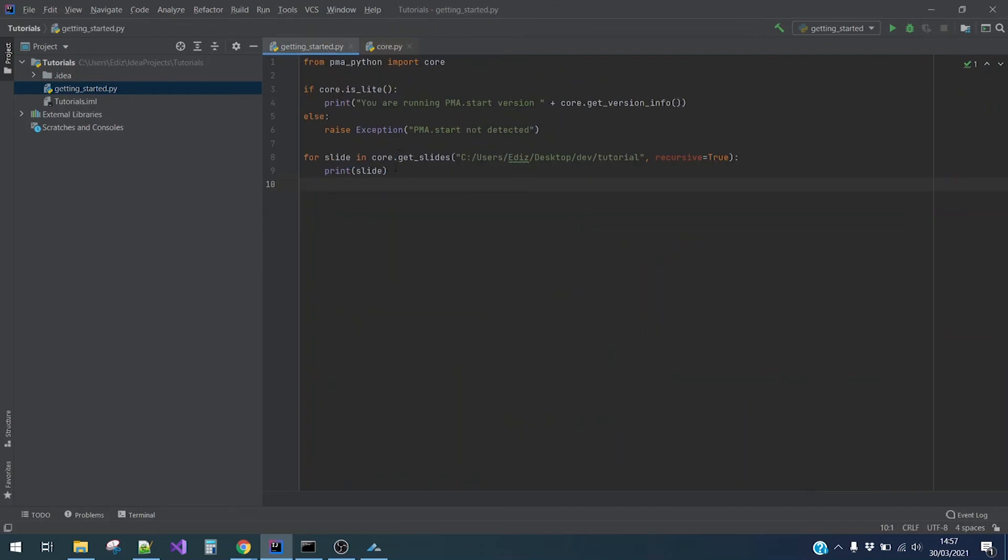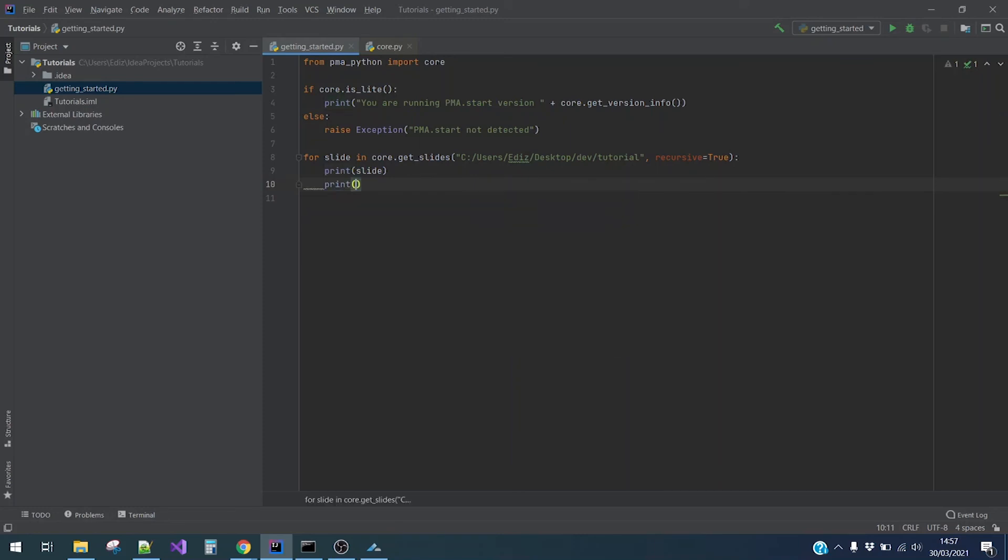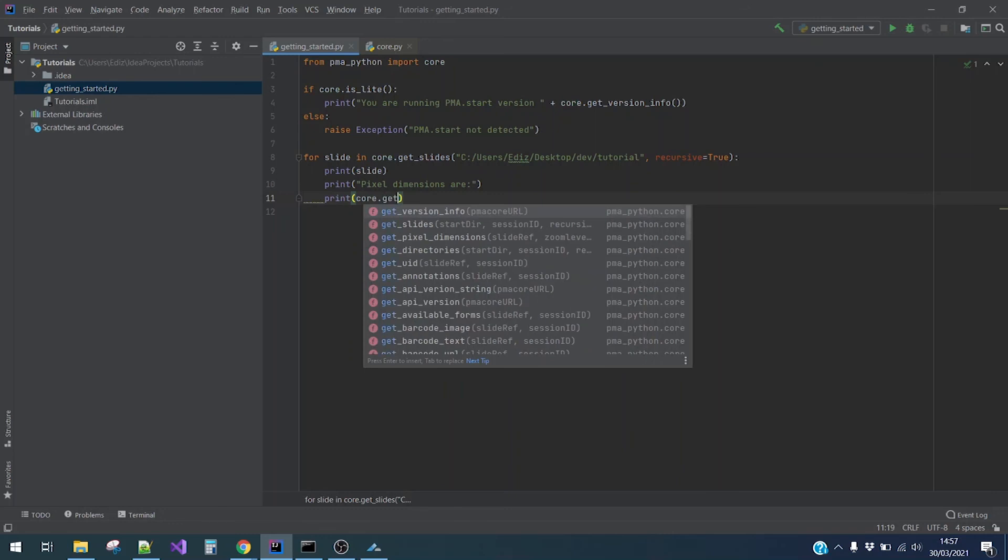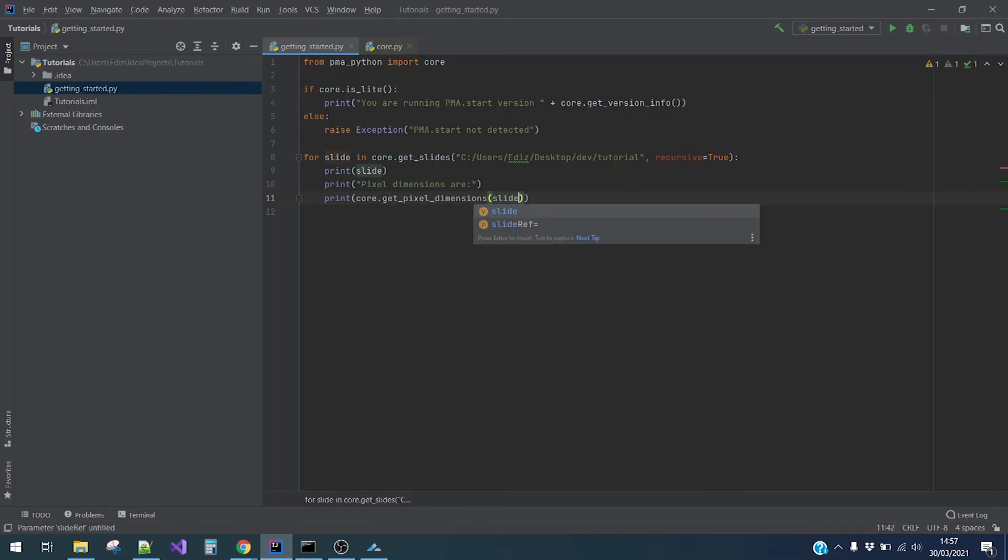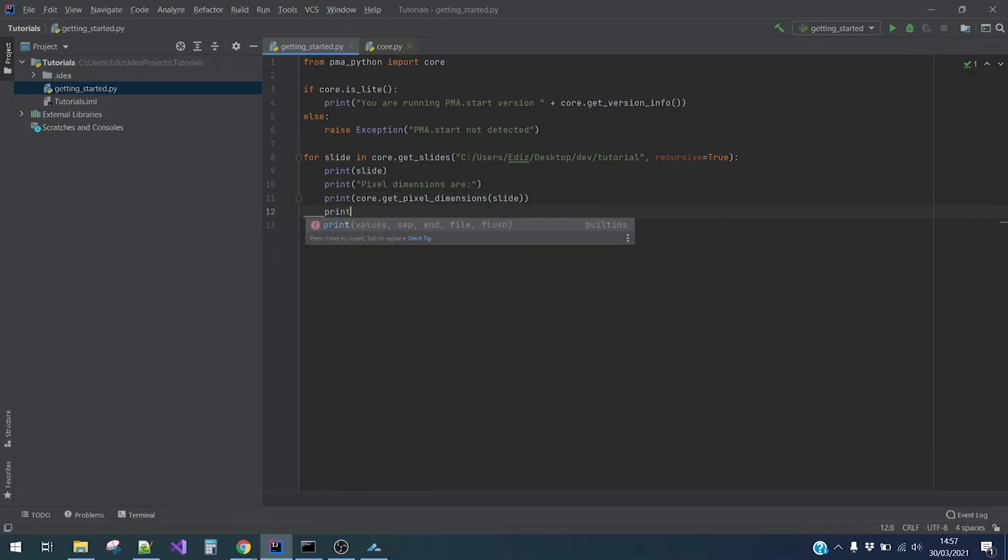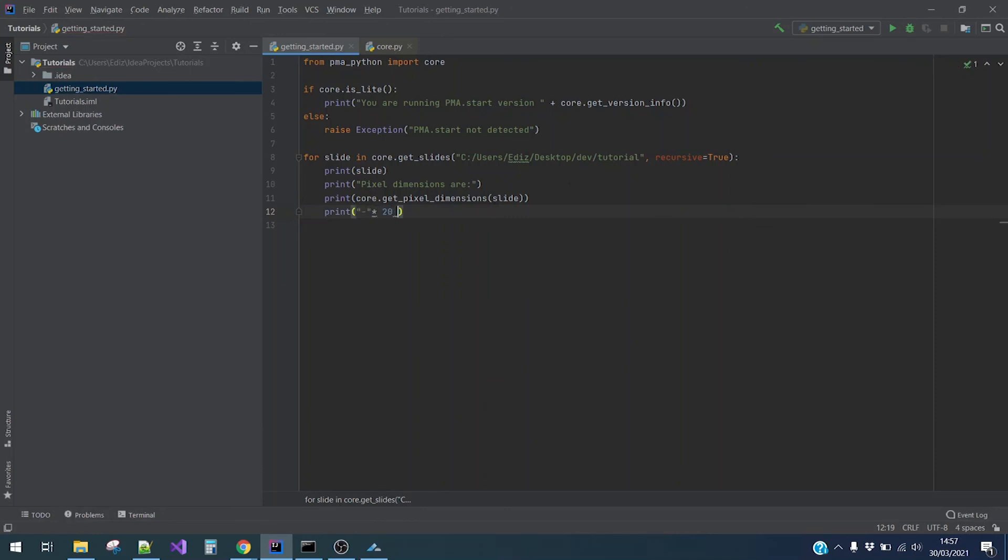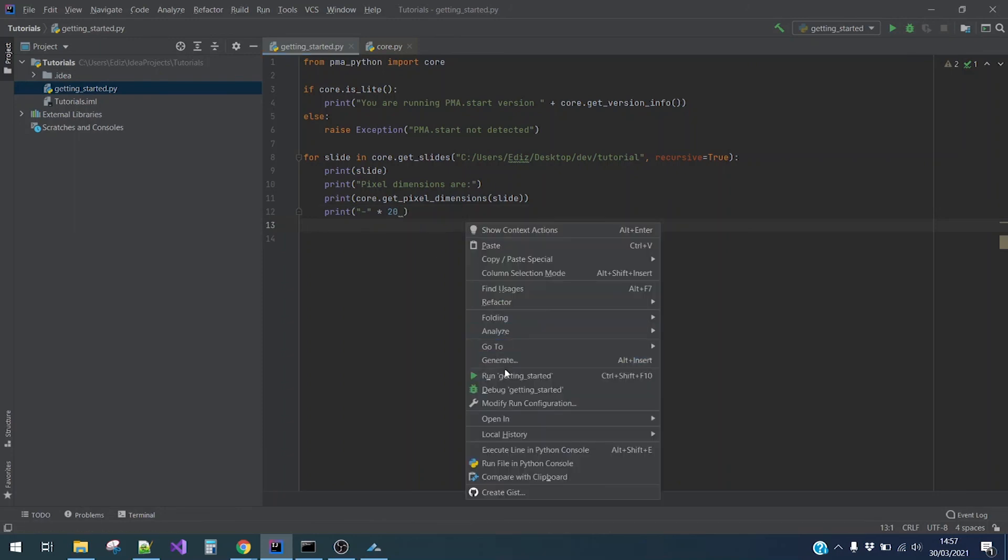We will print the message that the pixel dimensions are. Then we will print core.getPixelDimensions slide. And because we have two files at the moment, let me quickly write some separation lines. Okay, so let me run the code.